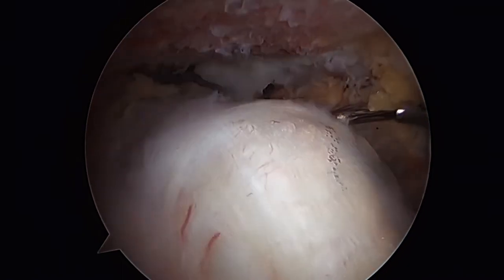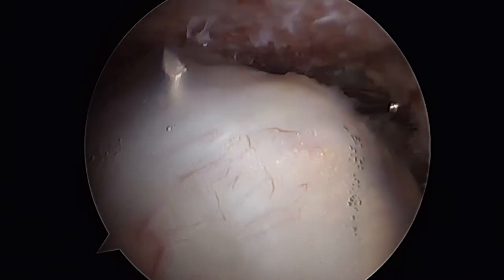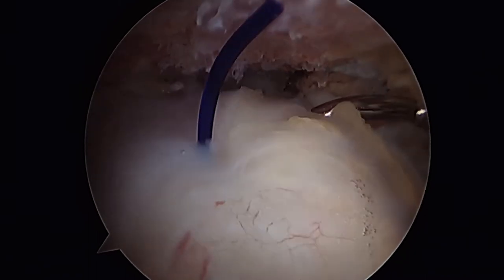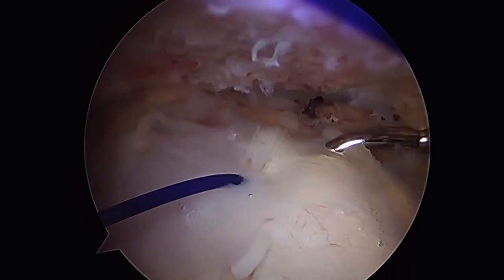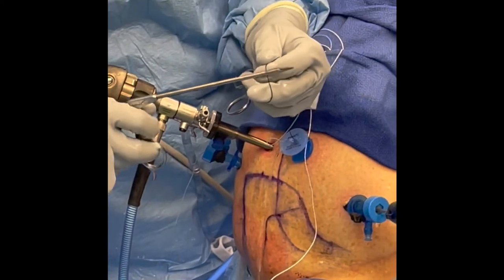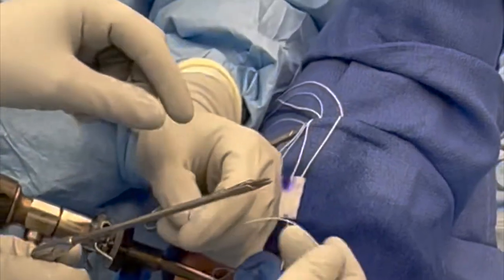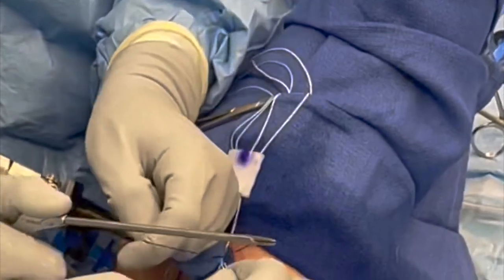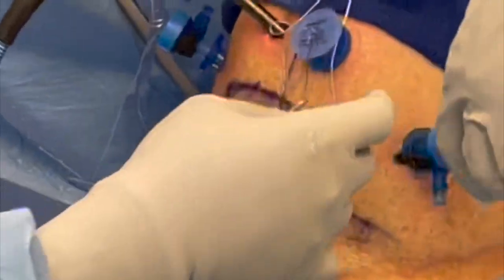These suture hooks are excellent for performing these through-and-through stitches, and these stitches have been found to be extremely strong even in poor rotator cuff tissue. We'll use the blue shuttling suture to pass the second anterior stick knot limb through the cuff, approximately one centimeter medial to the tendon edge and 1.5 to 2 centimeters anterior to the first stick. This second anterior stick suture is then shuttled down and through the native cuff.